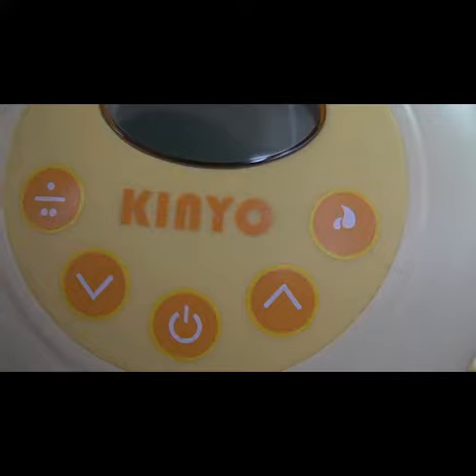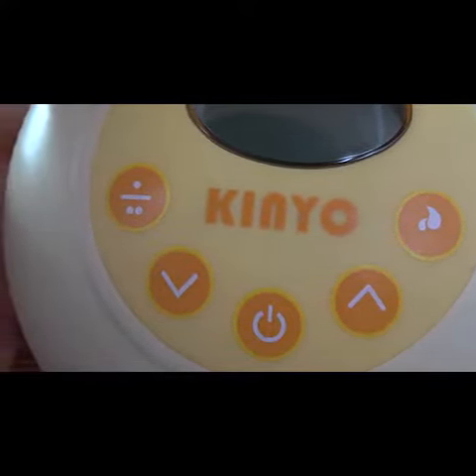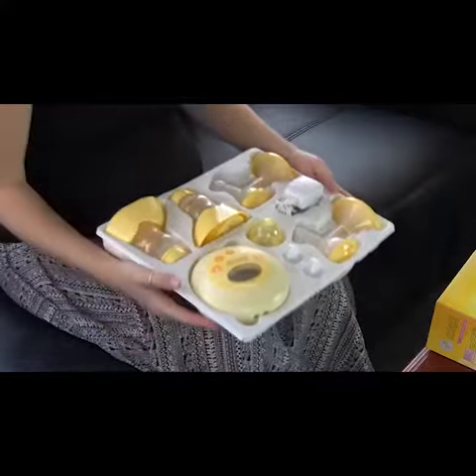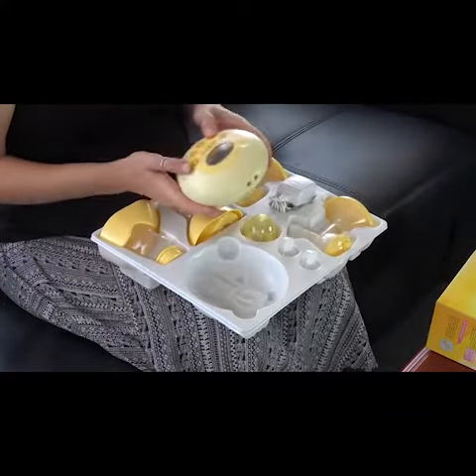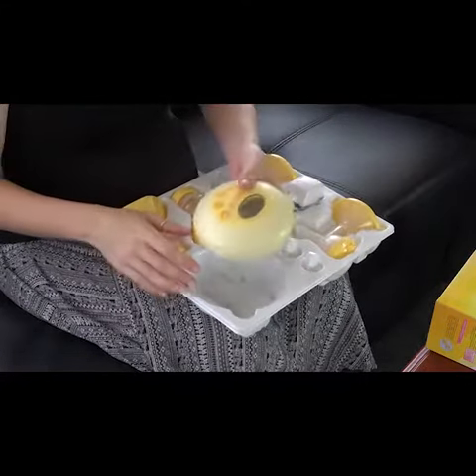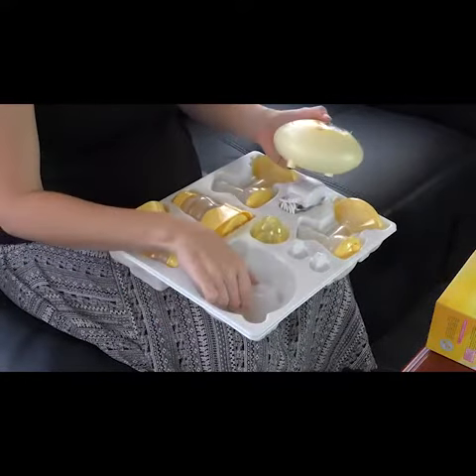Let's have a look at the product. As you can see, the box emphasizes that the pump is BPA free. For those that don't know, BPA is an abbreviation of Bisphenol A, a controversial industrial chemical used to make plastic. The Kinyo breast pump is made from a comfortable polypropylene material that is easy and, most importantly, safe to use. When you open the box, you can see that all the elements are quite compact and that the unit is portable enough to take with you in your baby bag.